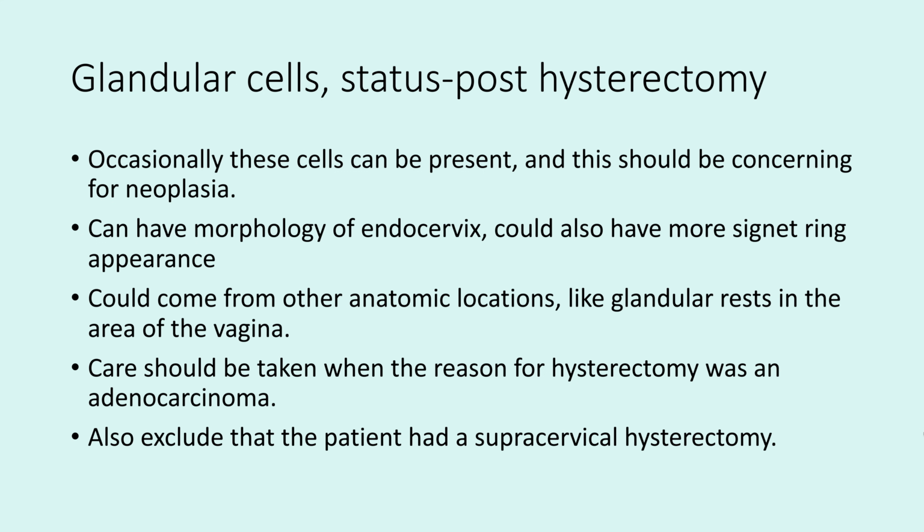And then look closely to make sure that they're not atypical. Even if they're not atypical, I usually note this. And I'm very careful to note, especially if I don't know the patient's history and I have no way of finding it out, that I'm concerned and that they need to work this up.